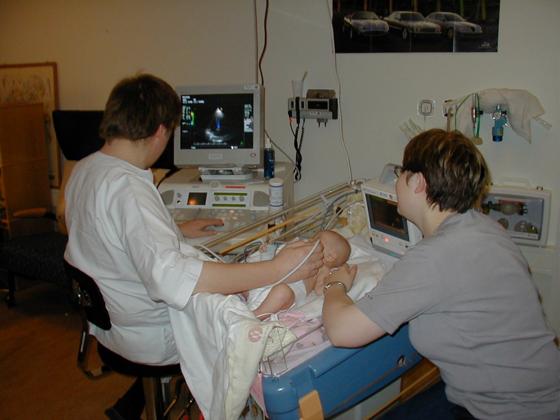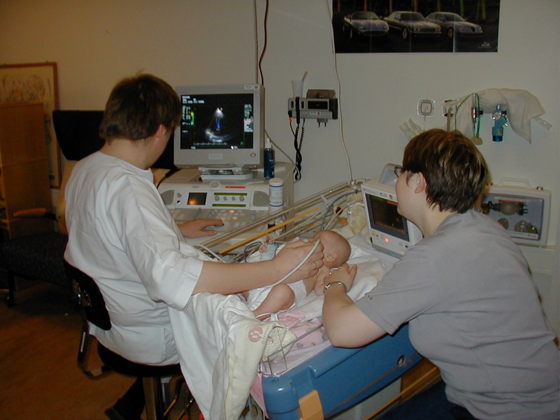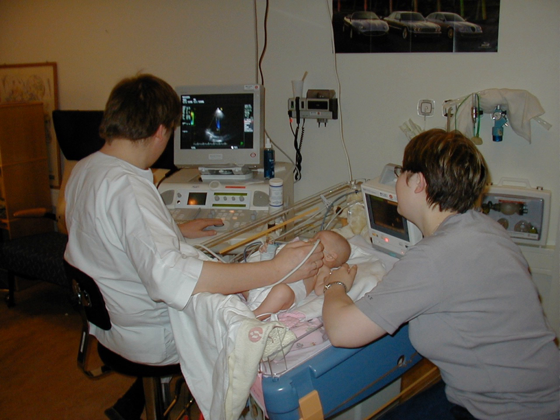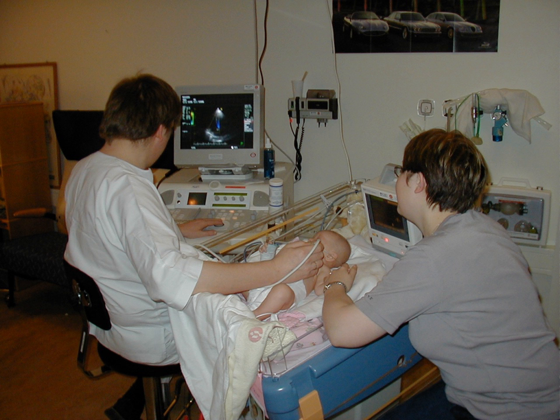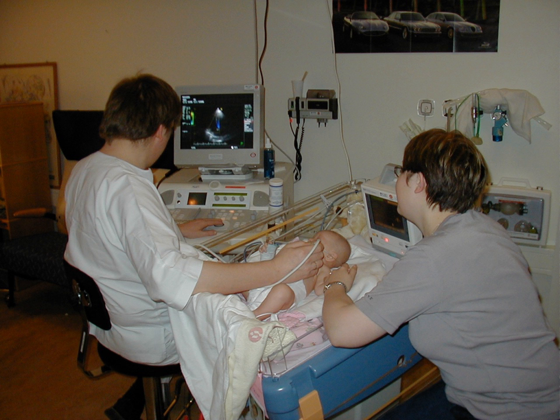Ultrasound refers to sound waves with frequencies higher than those audible to humans, greater than 20,000 hertz. Ultrasonic images, also known as sonograms, are made by sending pulses of ultrasound into tissue using a probe. The ultrasound pulses echo off tissues with different reflection properties and are recorded and displayed as an image. The commonest is a B-mode image (brightness), which displays the acoustic impedance of a two-dimensional cross-section of tissue.